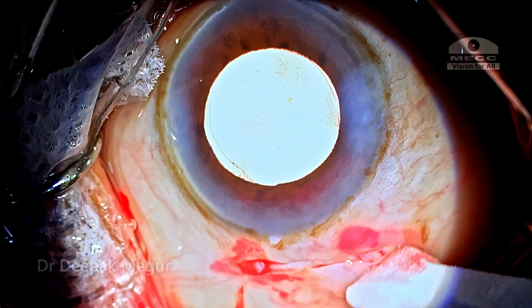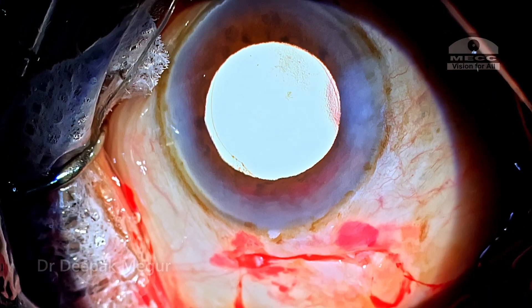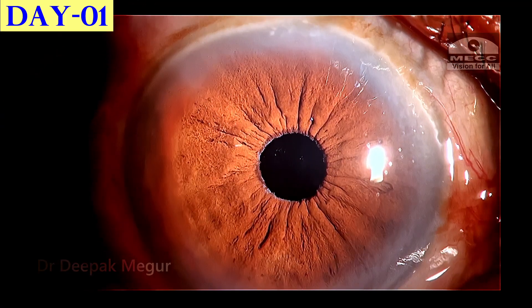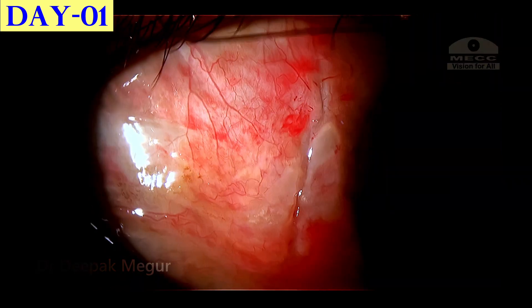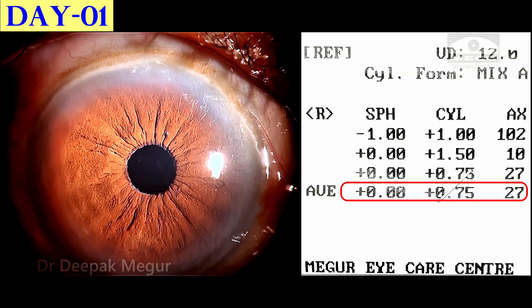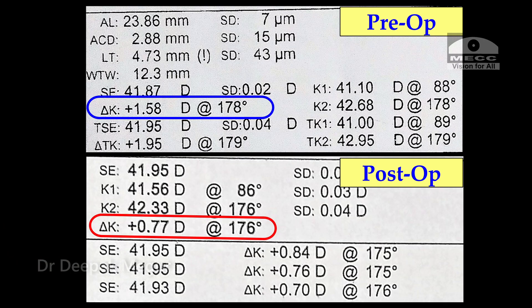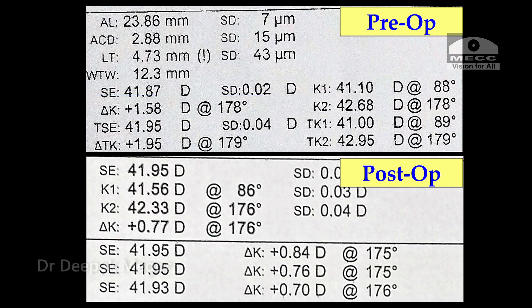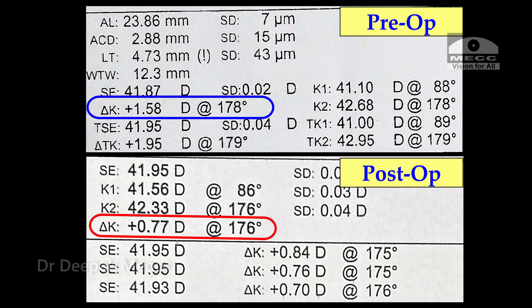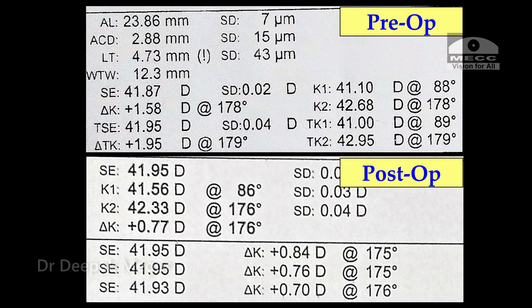I'm not using any cautery. Let's see how things are on the first post-op day. The autorefractometer reading and the keratometer reading show a reduction of 0.75 diopters of against-the-rule astigmatism.